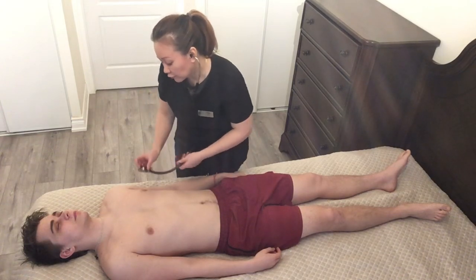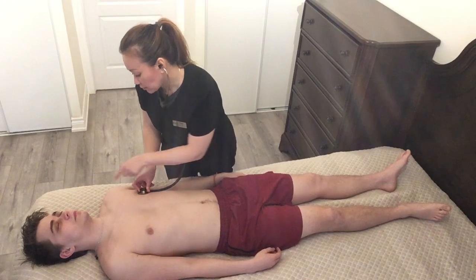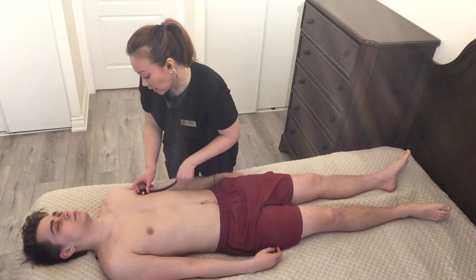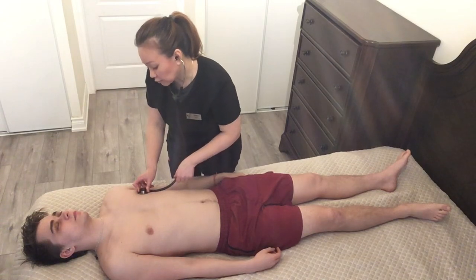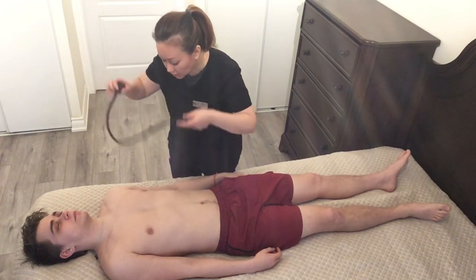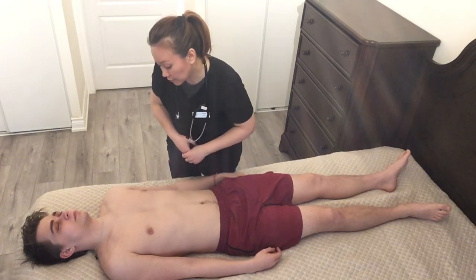Now I will listen for a full minute at the apical pulse located at the fifth intercostal space, mid-clavicular line, left side of the chest for a full minute. Patient has 70 beats per minute, what is normal. Usually it's checked before administering digoxin or if radial pulse is weak or irregular.